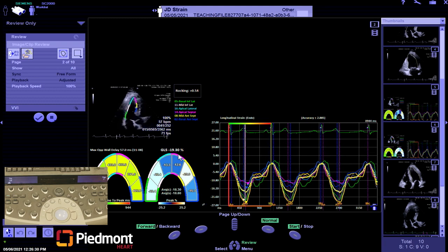If, in fact, this is a very important patient that you think needs strain processing done, and it's not tracking or not doing something correctly, the thing I would suggest is first, don't let the patient leave just yet. Go ask a senior sonographer or a fellow coworker to come and take a look.